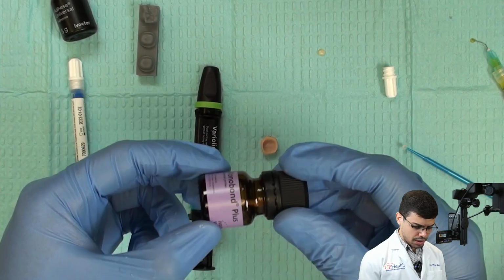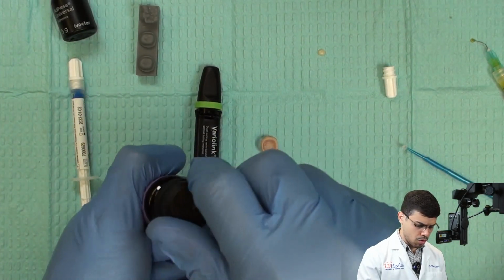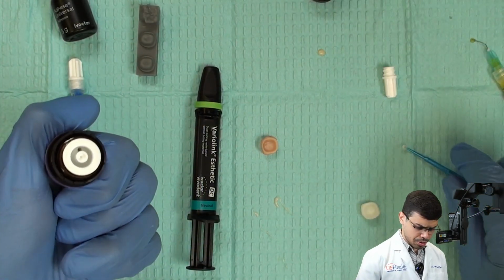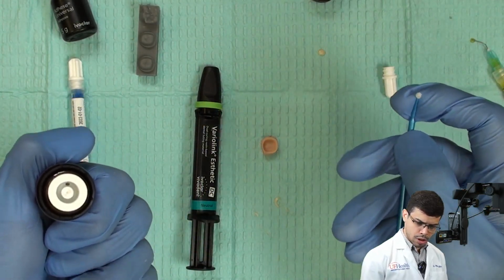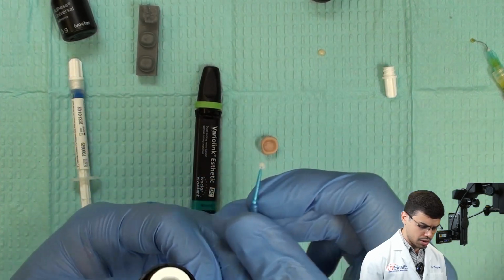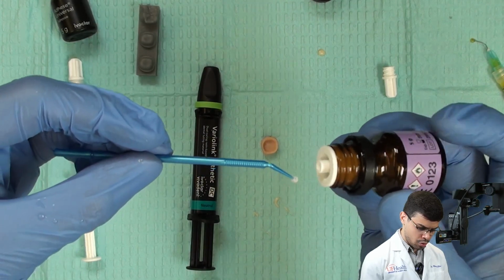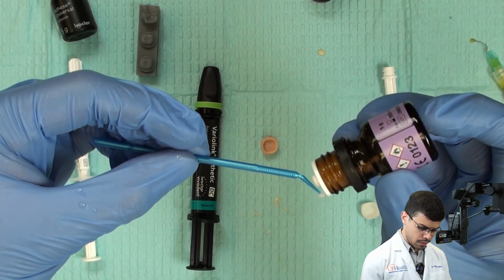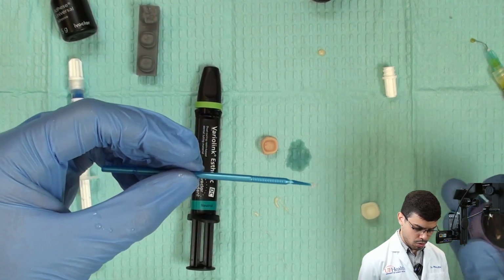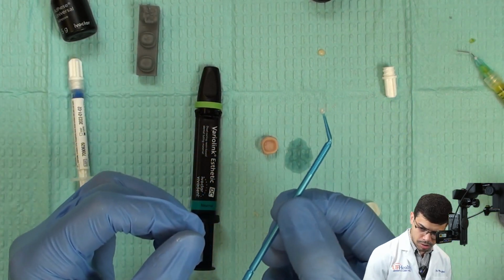So the Monobond Plus, the silane part of it will act right now. So what I'm gonna do is I'm gonna open this bottle, okay? You can put that on a dappen dish or something like that, or you can do a little trick here with a microbrush. So what you can do is you bend the microbrush, you never put it on the tip. What you do is you put it on the neck of it. So you just go with the drop, and this drop will go to the tip, and that's the right amount. You see here, the drop.